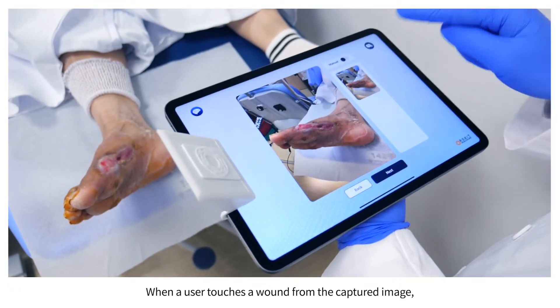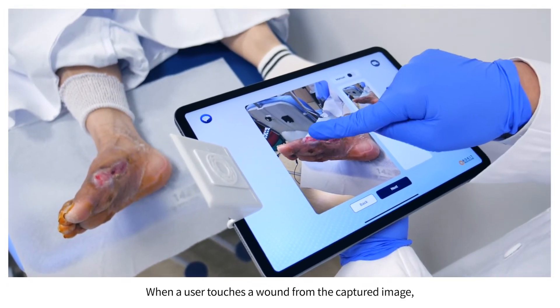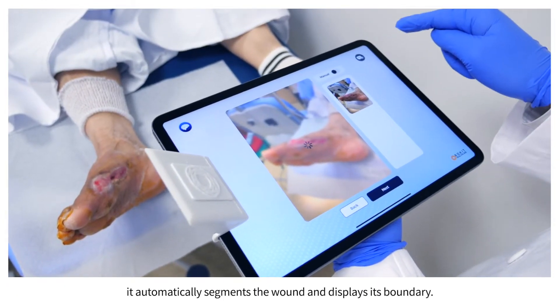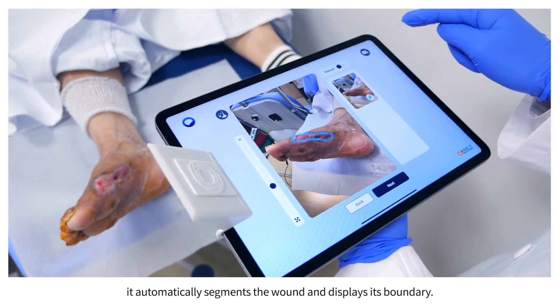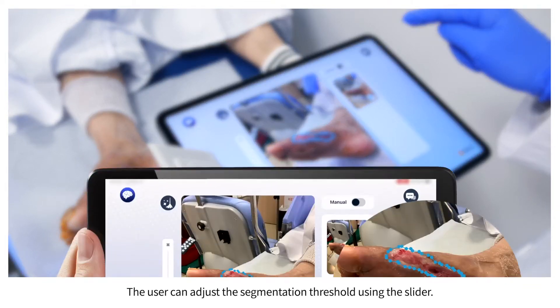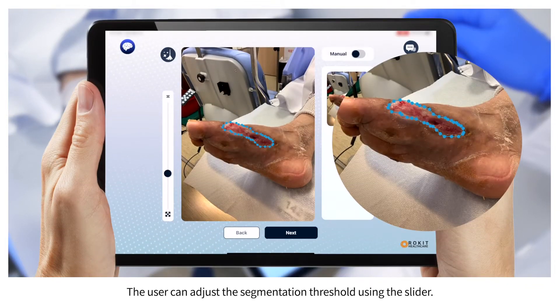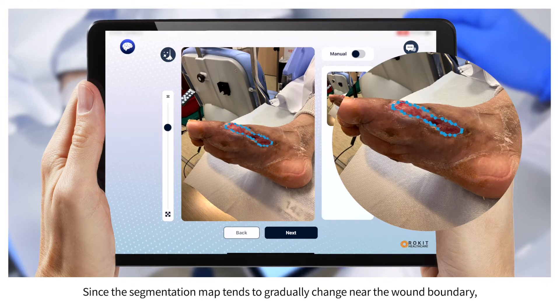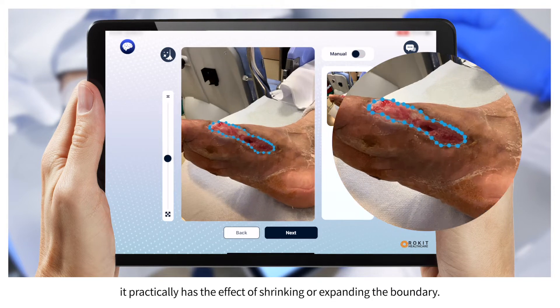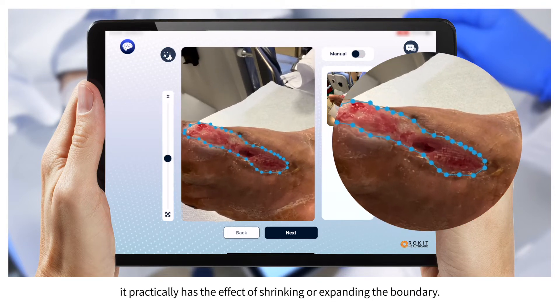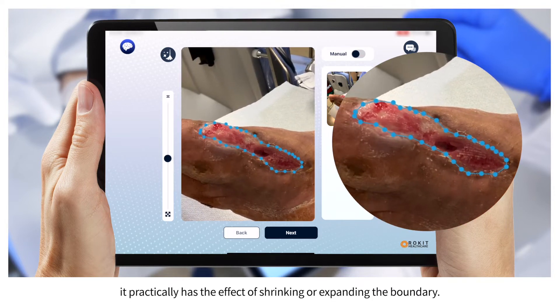When a user touches a wound from the captured image, it automatically segments the wound and displays its boundary. The user can adjust the segmentation threshold using the slider. Since the segmentation map tends to gradually change near the wound boundary, it practically has the effect of shrinking or expanding the boundary.